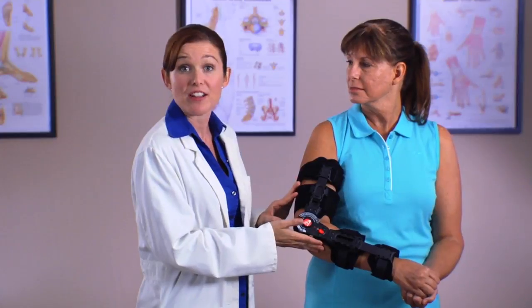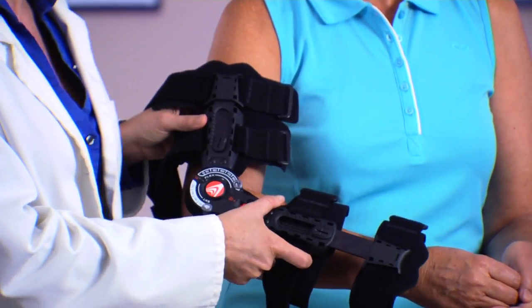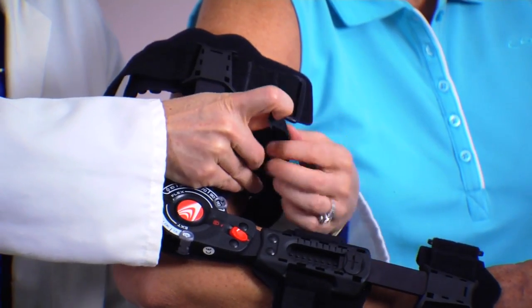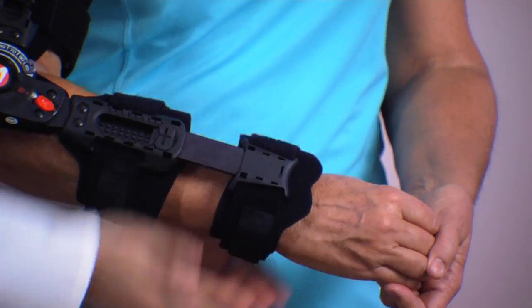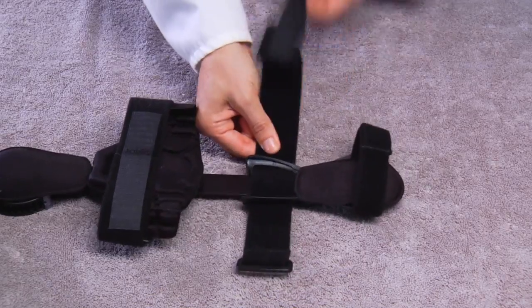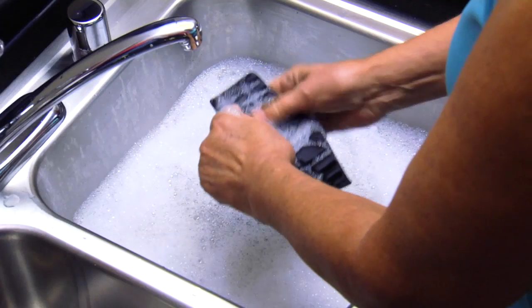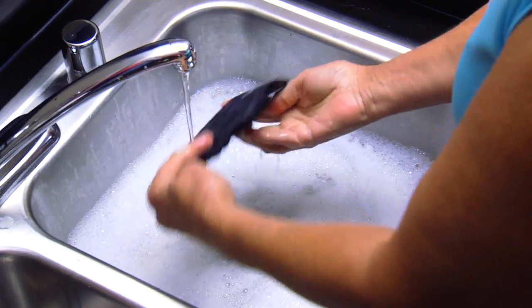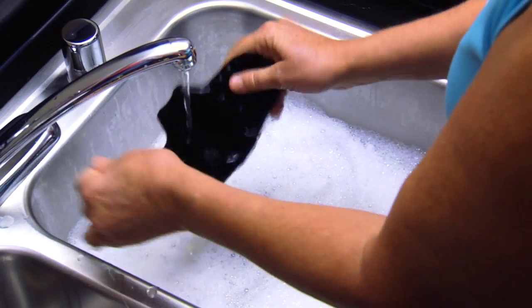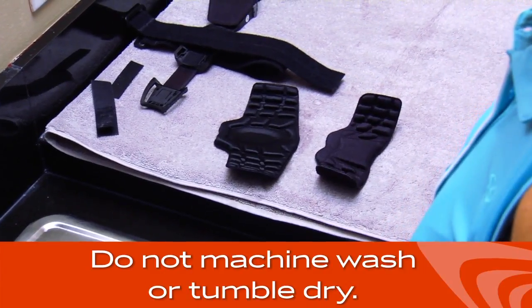After the initial fitting and application, the T-Scope Elbow Premier Brace may be removed and reapplied easily. Align the hinge over the center of the elbow joint and apply the straps to the D-rings and affix the velcro tabs. The patient will not have to adjust anything else on the brace. Straps and foam pads may be removed by sliding the straps out of the strut housings. Hand wash the foam pads and straps with mild soap, rinse thoroughly with fresh water, and air dry. Do not place pads or straps into a mechanical dryer.